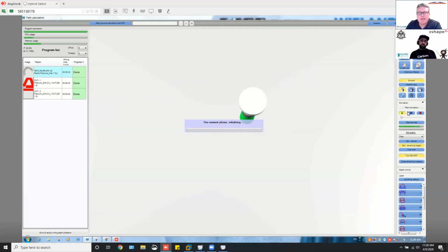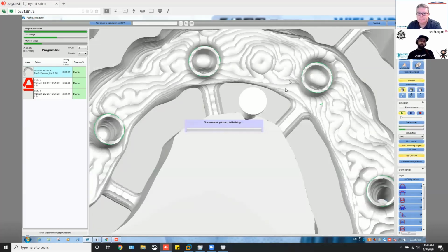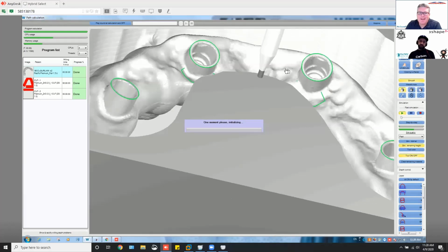Yeah, just the setup, right? Setting up is one part of the thing, and I'll run you through that as well. But simulation is the biggest thing on these cases. You always have to do that. Always. If you don't, you either got some big cojones or you got money that you don't care about. Yeah, and time. Time is the big one here, because if you don't have time to do it right, how do you have time to do it over?